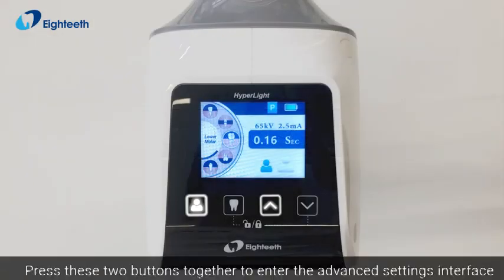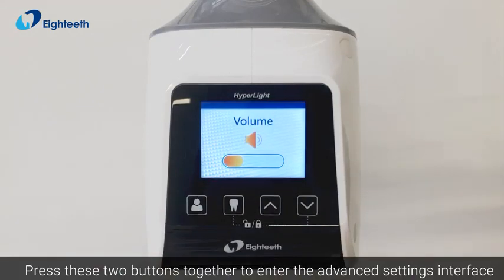Advanced settings: press these two buttons together to enter the advanced settings interface.